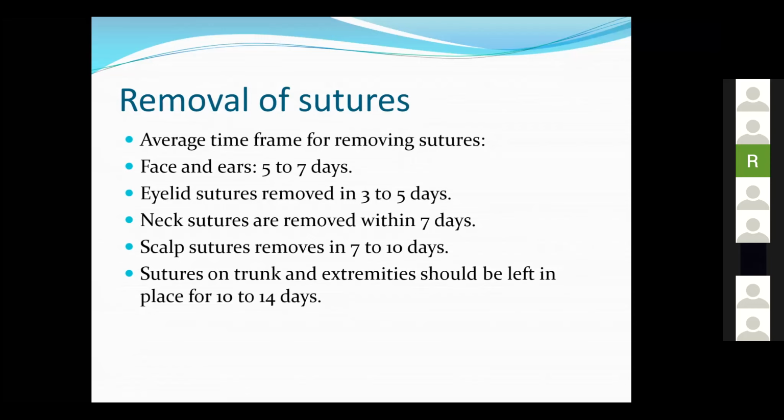So unless you go back and remove that knot, obviously after adequate time, once the wound is completely healed, you have to end up doing that. So for Prolene or monofilament, non-absorbable, you have to hide your knot somewhere under the abdominal wall or in the subcutaneous tissue, so that your knot is not there to irritate the skin constantly.